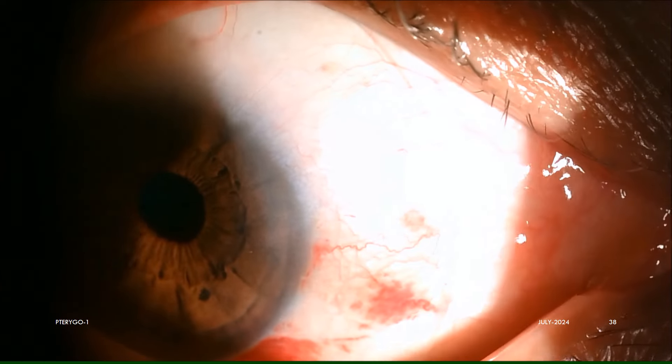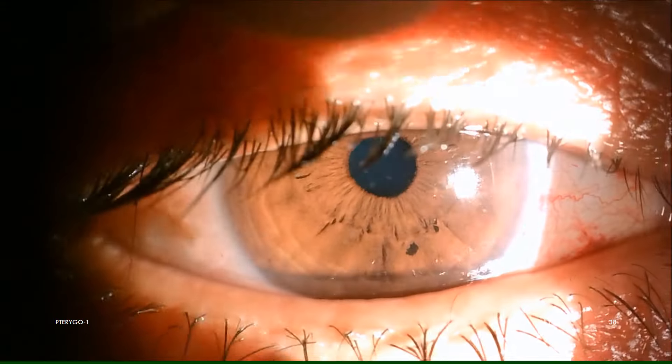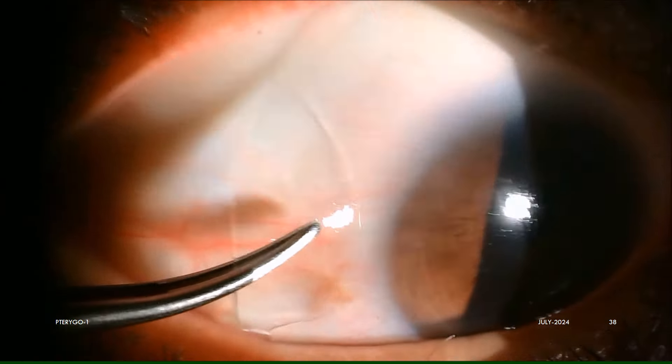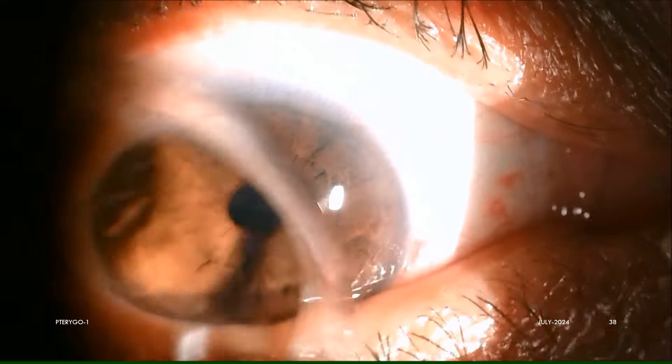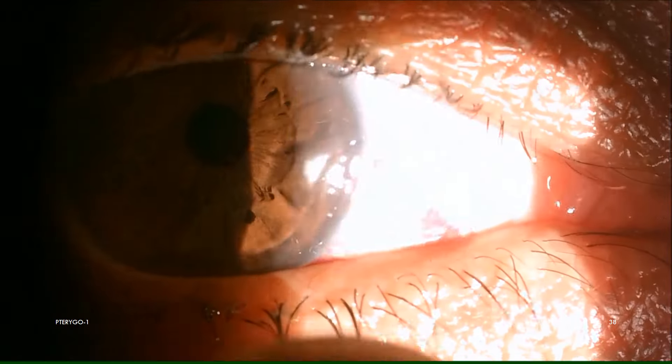This is one week post-op, and on the slit lamp, under proparacaine topical anesthesia, we gently remove the BCL with McPherson forceps. As we can see, the graft is already well taken up and has healed so well.